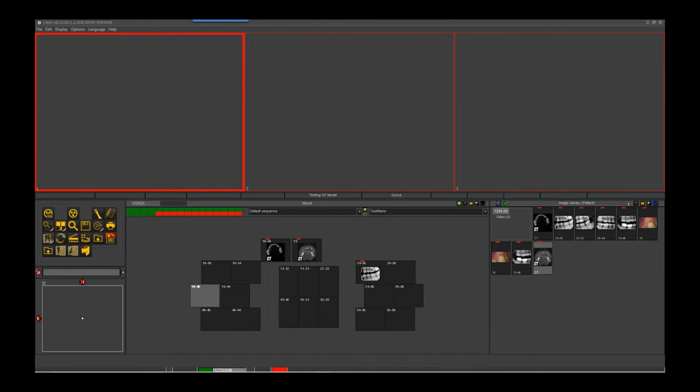Yeah, I think everybody's nervous about the cloud and the images, and then just the unknown, right? Nobody knows how much it's going to cost, and then you're kind of held hostage once you start, if you decide you don't want to do it, because you've already got all these images over there. So the whole thing has upset the whole world. You stop making payments and you're cut off. Right. Or the internet goes down and you don't have any way of uploading or downloading images. Right, which, unfortunately, happens more times than I would like. I think the more dependent we are on it, the greater the pain point of it going down.